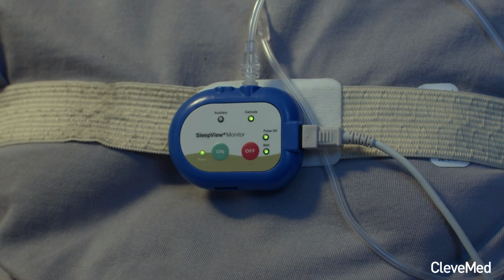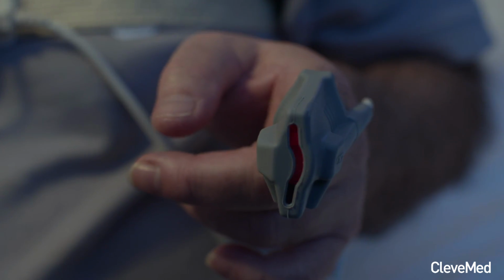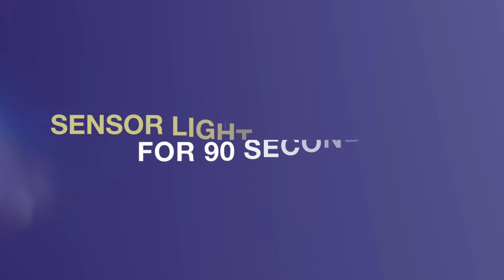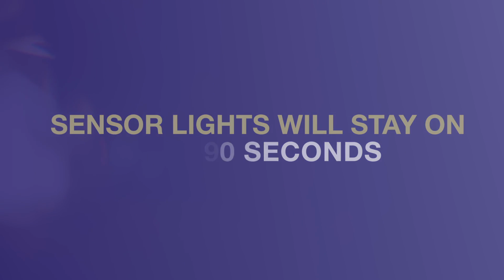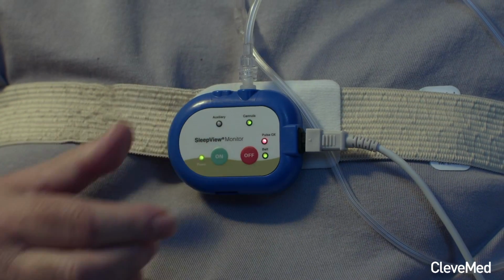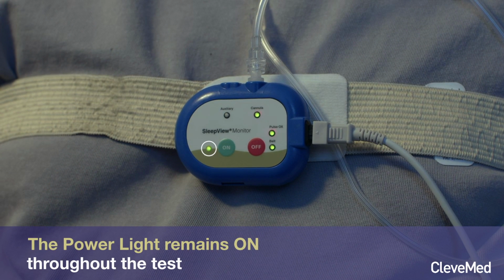Remember, the light inside the pulse ox sensor will always remain red, while the light on the SleepView Monitor should be green when sensor lights are lit. The sensor lights will stay on for 90 seconds, but if you need more time to adjust the sensors, simply press the On button again to turn the sensor lights on for 30-second increments. The power light will remain on during the entire test.